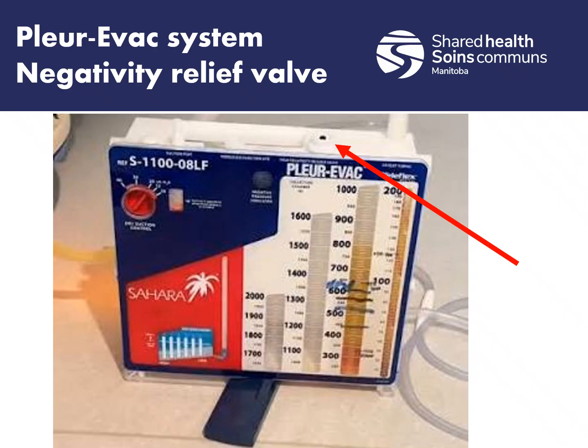Now the problem is if suction is not operative, or if operating on gravity drainage, depressing the high negativity relief valve can reduce negative pressure within the collection chamber to 0. So basically make it atmospheric pressure, with the resulting possibility of not letting air drain properly, so you can actually make their pneumothorax worse. So we don't want to be touching this button. This is something for the sending or receiving facility to deal with when they're changing their negative pressures, which we don't do either.